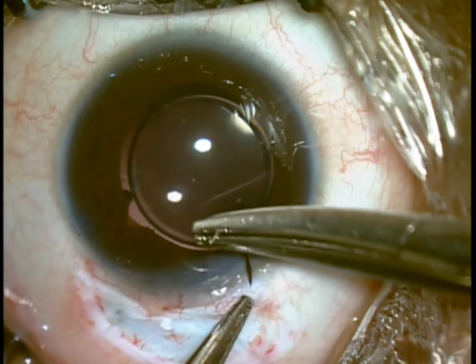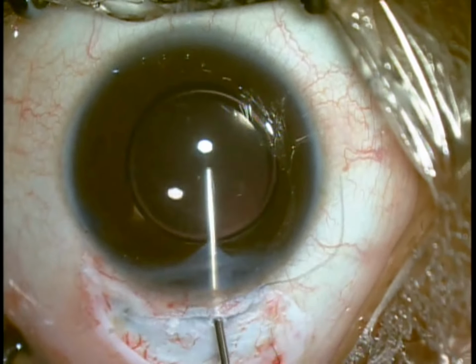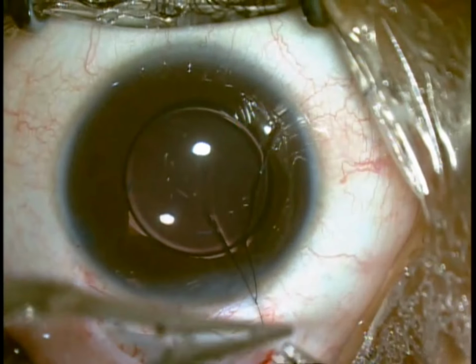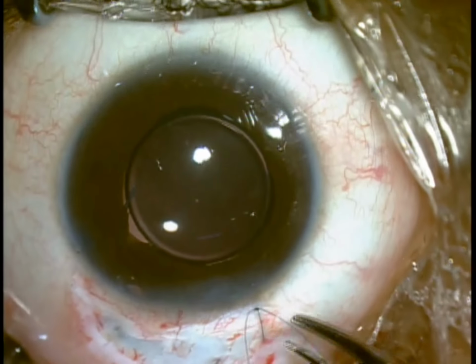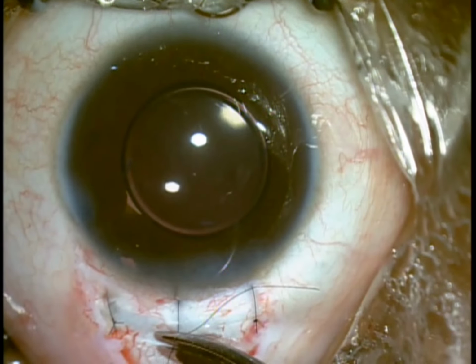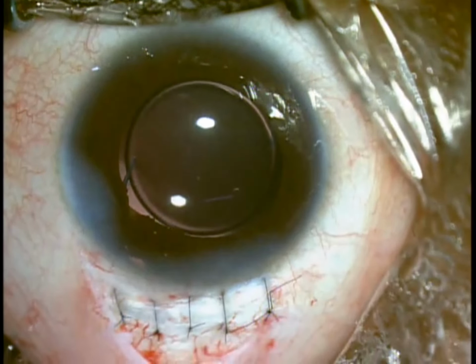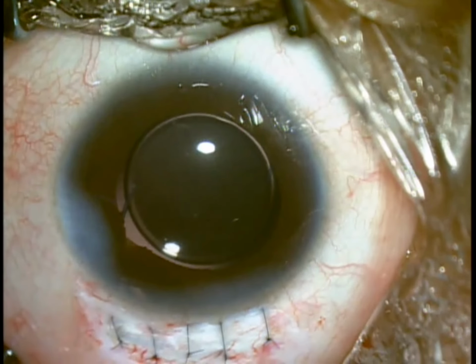Section closed with nylon 10-0 sutures, 5 sutures applied. Conjunctival closure done and eye patched.